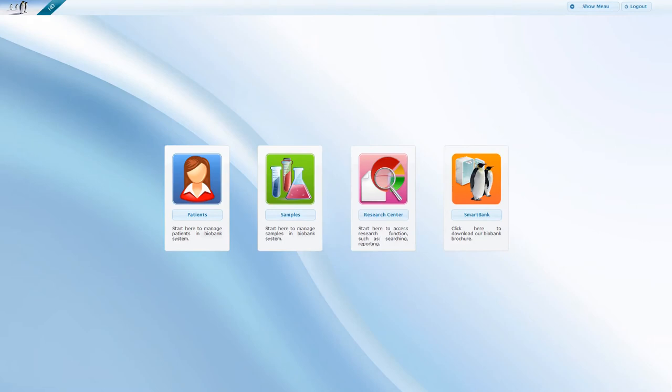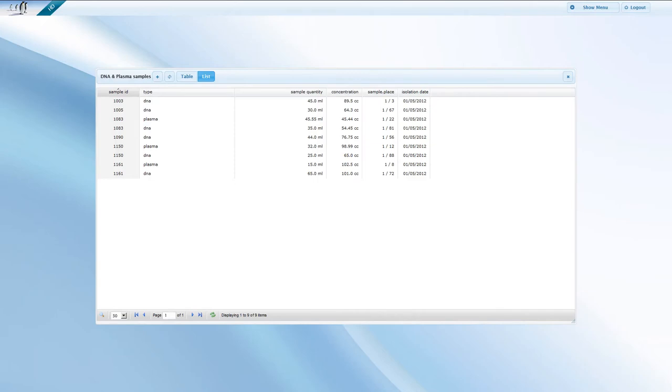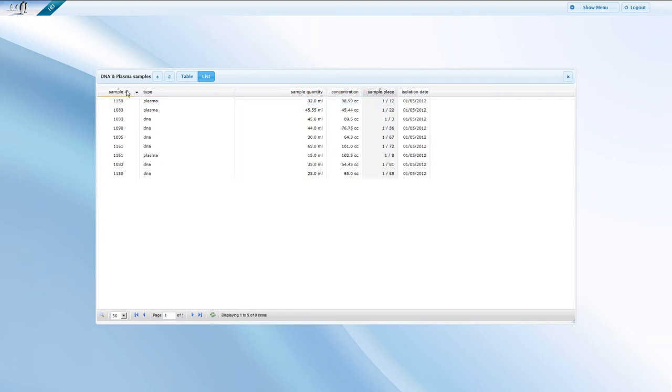Let us now examine the second main module, Samples. There are currently nine samples listed in this demo. All columns are customizable according to the type of samples and the requirements of the project. The column headers are also clickable enabling quick sorting by category.